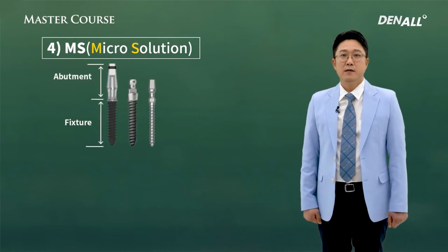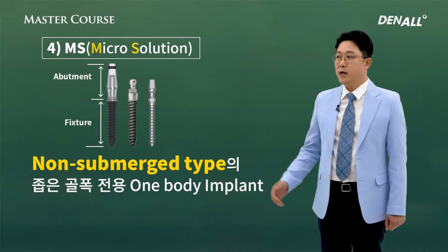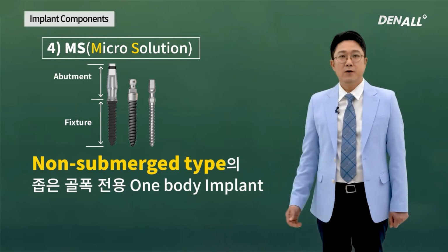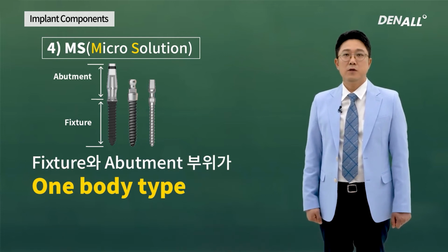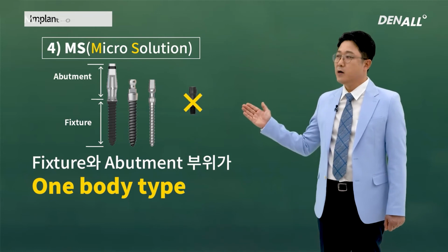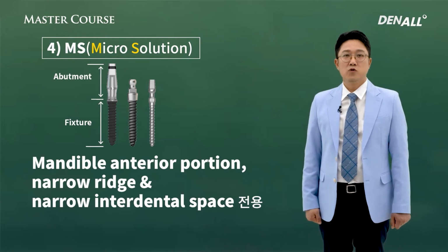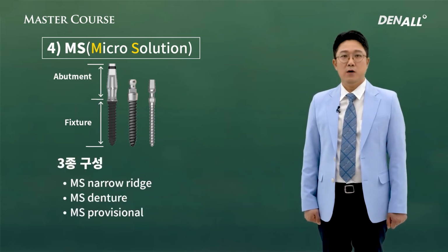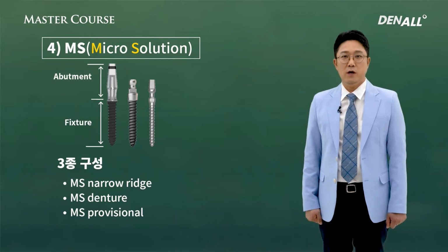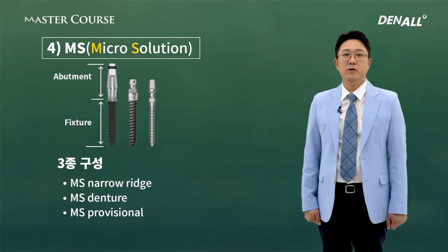Next, let's look at MS implant. First, it can be used for narrow ridges like lower anterior, and as shown, fixture and abutment is one piece, one body type. Therefore, there's no necessity for a screw that connects abutment and fixture. Like lower anterior, in the case there's narrow ridge and narrow interdental space, it is very useful. Depending on abutment shape, you can create crown accordingly, and you can use it for supporting denture and for temporary teeth.